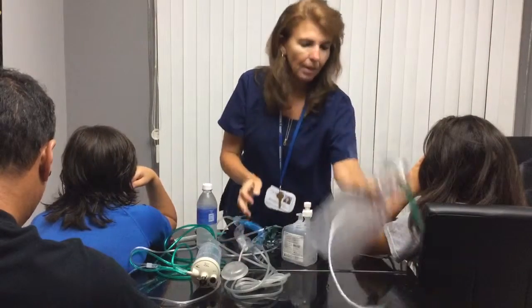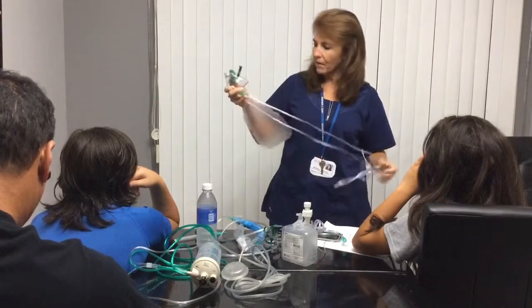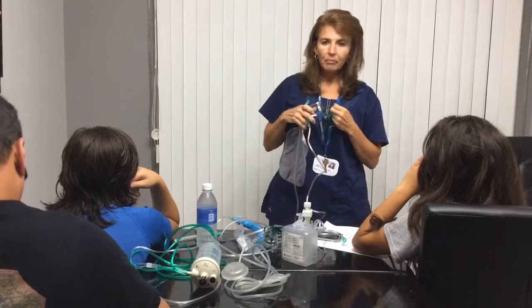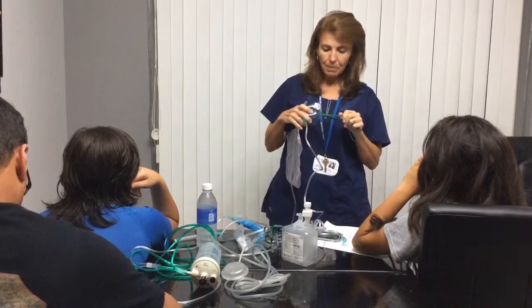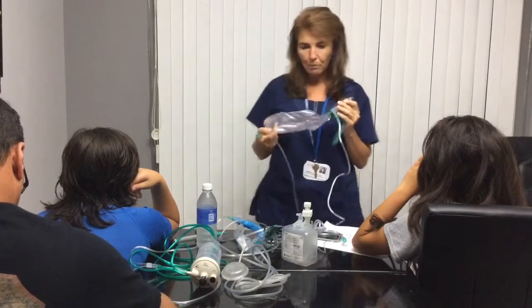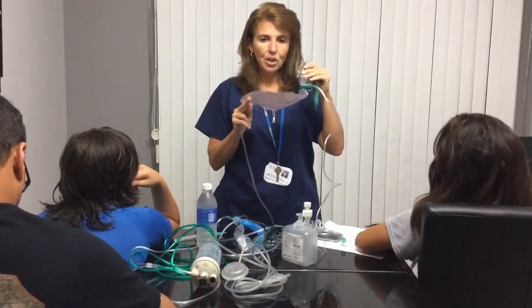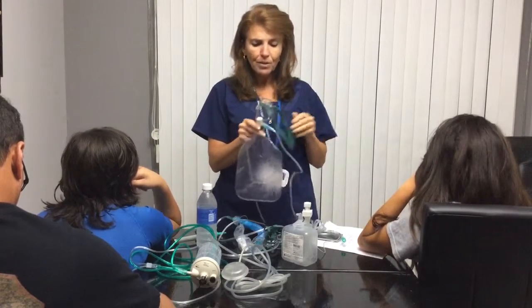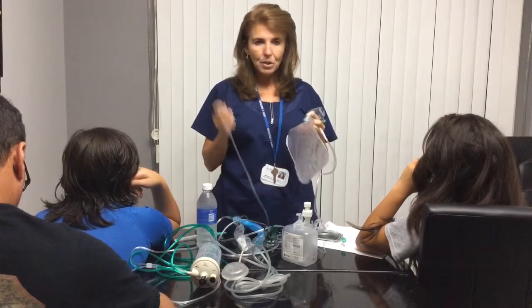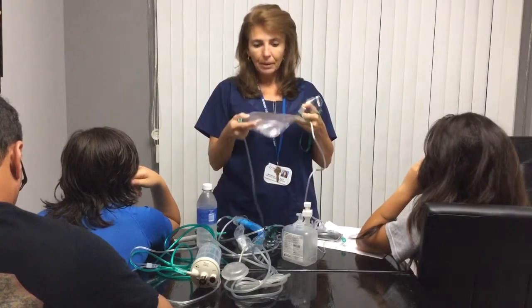Last, short of someone requiring either intubation or non-invasive ventilation in an emergent situation such as a medical response, the nurse may ask you to get a non-rebreather. So as you're retrieving from the Omnicell, you're going to want to look for the device that has the oxygen attached bag. With this bag, we want to make sure that we have adequate flow going to the bag. So when it's connected to an oxygen source, the bag fills completely up.